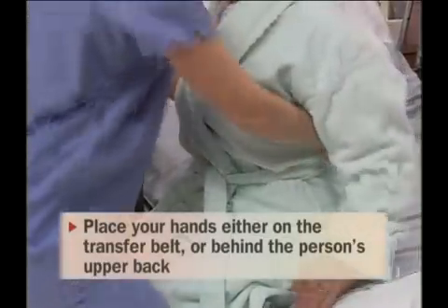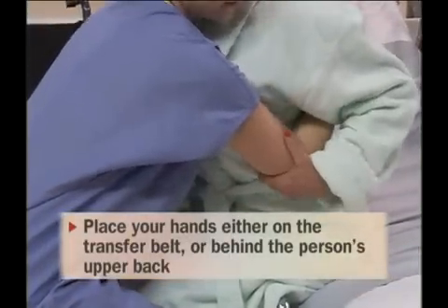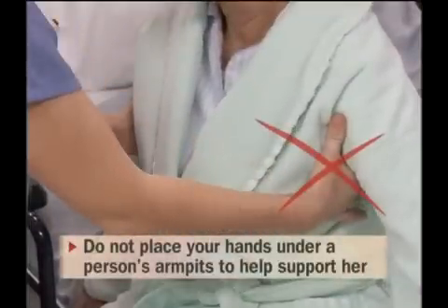To help support the person, place your hands either on the transfer belt or behind the person's upper back. Do not place your hands under a person's armpits to help support her, because if the person falls, she may be injured when you lift up as she is falling down. It's important to note that some patients or residents may have medical conditions that make it dangerous to use a transfer belt on them. For example, a transfer belt should not be applied to a person who is recovering from abdominal surgery. Transfer belts are also not used with people with certain heart disorders. If you are in doubt about using a transfer belt on a patient or resident, ask the nurse.